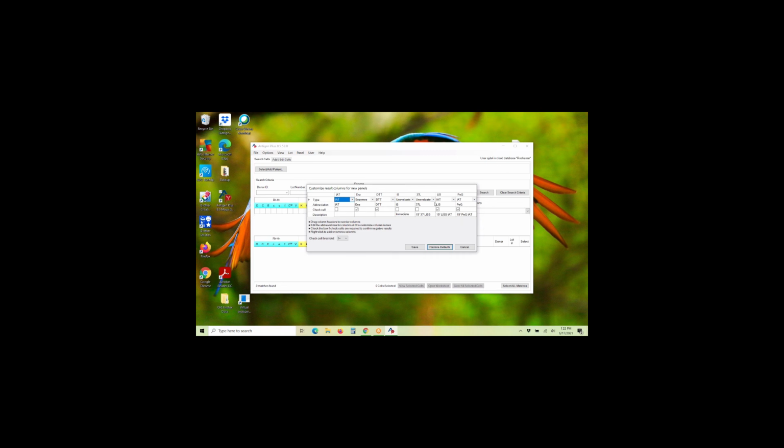And just as an example, for 37, we just wrote 15-minute 37 LISS. And for the LIS, where we only have 3 characters here, that's our 15-minute LISS IAT reading. And you can put here, some people prefer to write AHG, some people like to write IgG, whatever you're comfortable with as a description is fine. That's just going to appear at the bottom of your panel. So you can see all of your results at the bottom for each column will be down there. And you'll see that in a moment when we get to it.